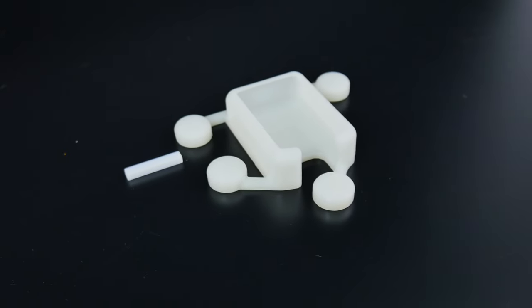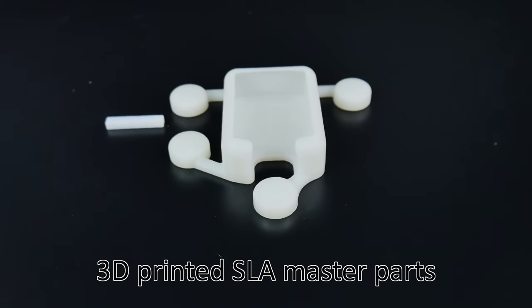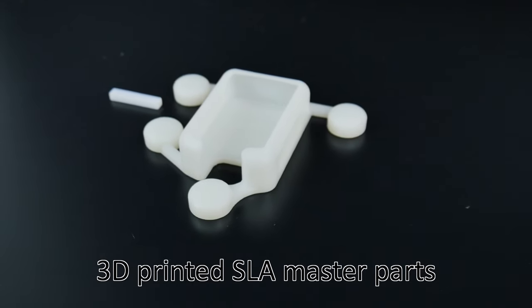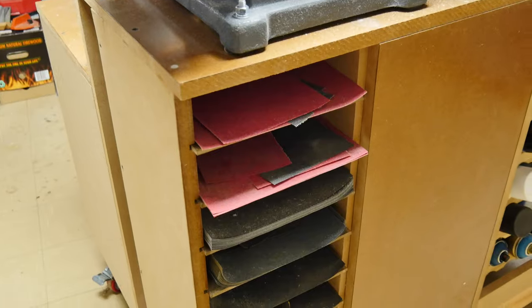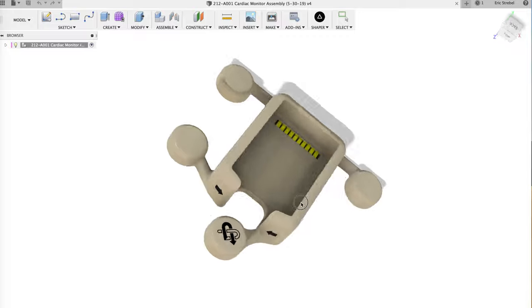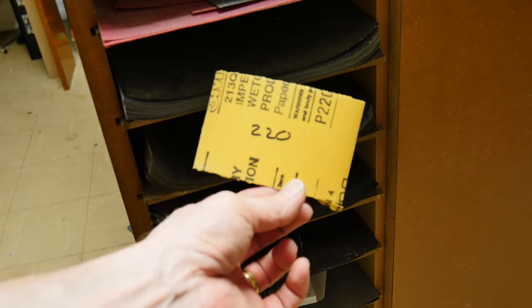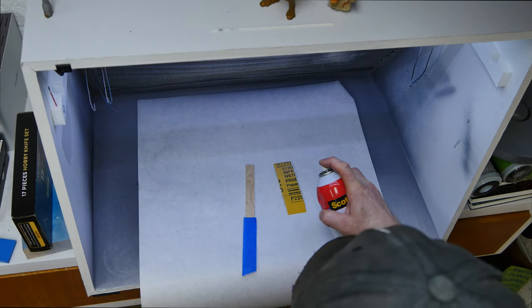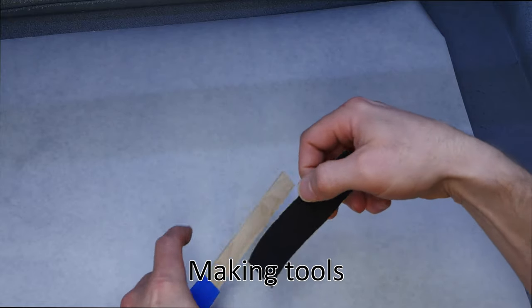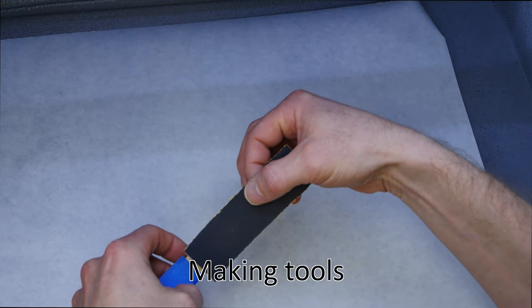This project started when my client On and On saw one of my videos and reached out asking if I could help them with some flexible overmolded medical parts. The project started with some 3D data and progressed to an SLA master. The process we're following in this video is: mastering that SLA part, making silicone molds, and then casting the overmolded parts.